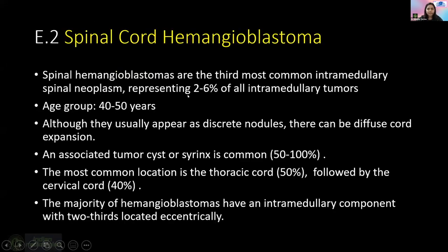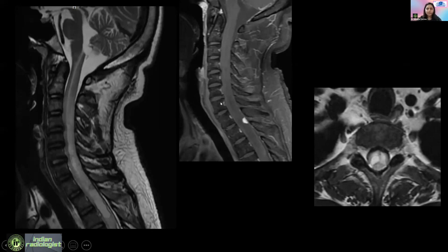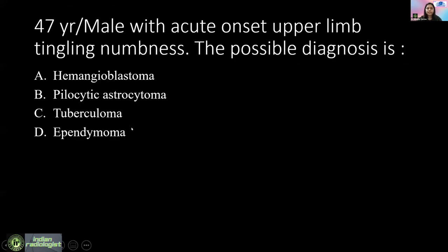What we saw here was a lesion which is relatively hypo-intense on T2-weighted images with a lot of perilesional edema, and nodular enhancement. There is no obvious large cystic component and no obvious hemorrhagic area. Anything in the spinal cord will always cause disproportionate edema because the spinal cord is a small, constricted space.